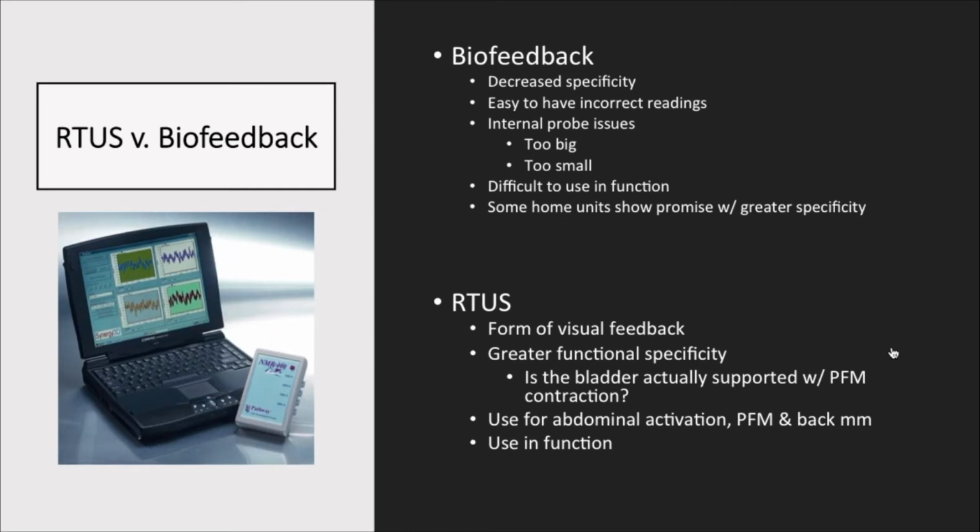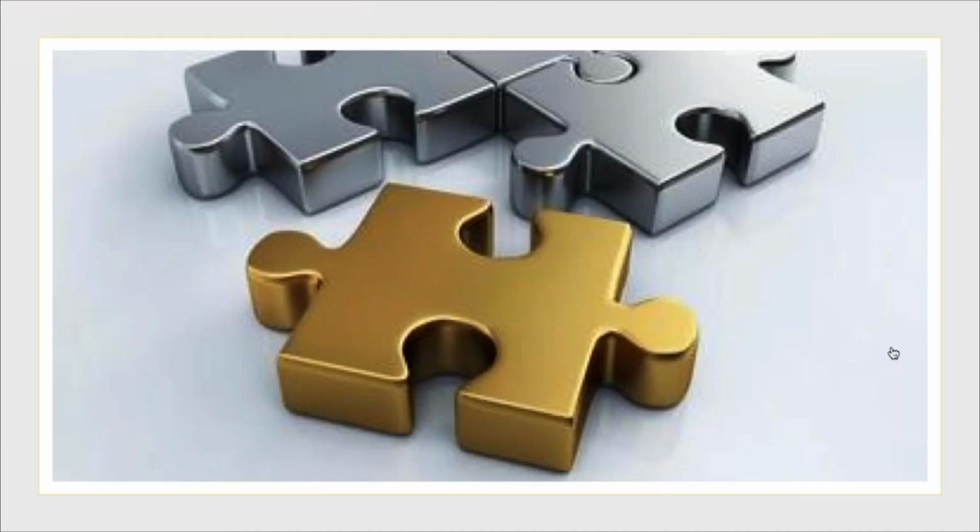So the muscle exam, again, we take a look at the superficial and the deep muscles of the pelvic floor. We're able to palpate that obturator internus that Megan highlighted. So if we do have patients with hip dysfunction, and quite often, I think more recently in the last 5 to 7 years or so, patients with FAI surgery or labral surgery may have an increased incidence of pelvic floor dysfunction, partially because of that relationship so closely between the hip rotators and the pelvic floor musculature. We're also able to assess strength and coordination digitally as well.